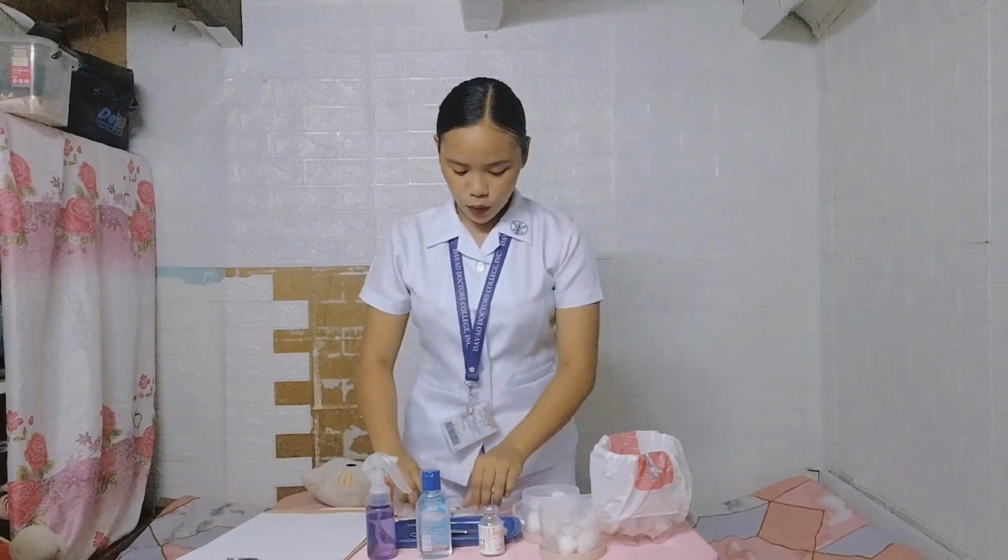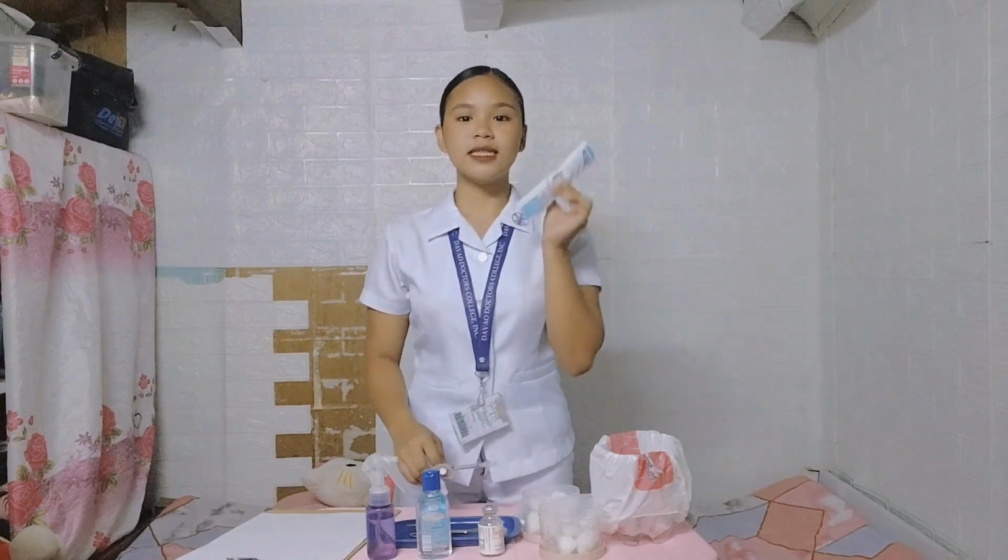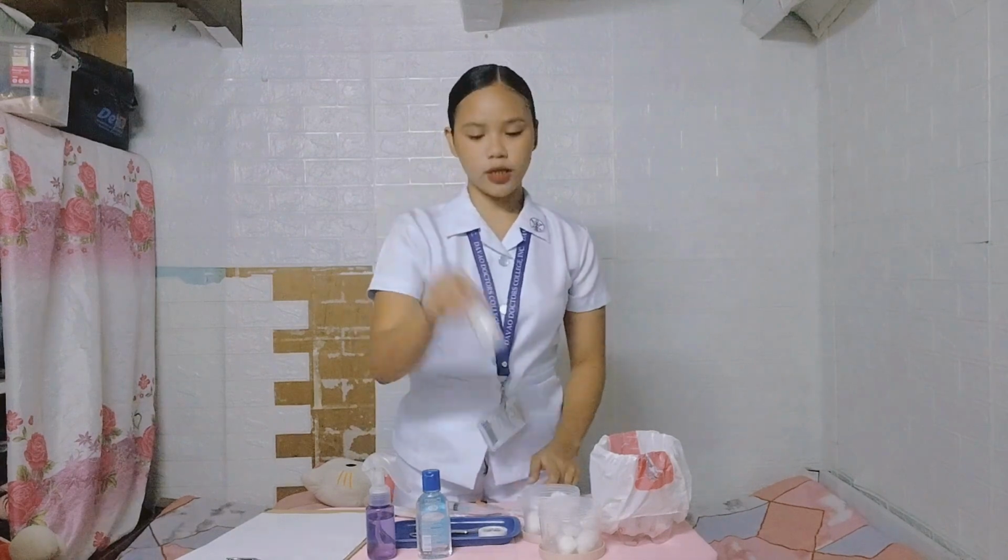Now prepare the necessary equipment needed to conserve time and energy. This includes the syringes. I have here the tuberculin syringe, insulin syringe, and the 5cc 23 syringes, aspirating needle, sterile water, cotton balls soaked in 70% alcohol and dry cotton balls, and also the waste receptacle. And now perform hand hygiene. This is done to prevent the spread of microorganisms and to observe other appropriate infection prevention procedures.